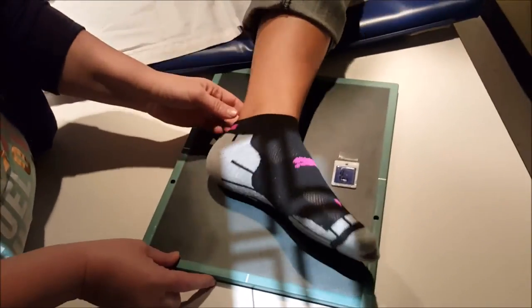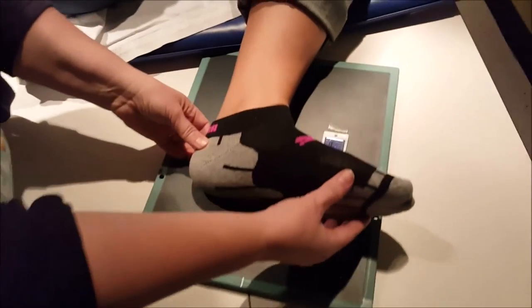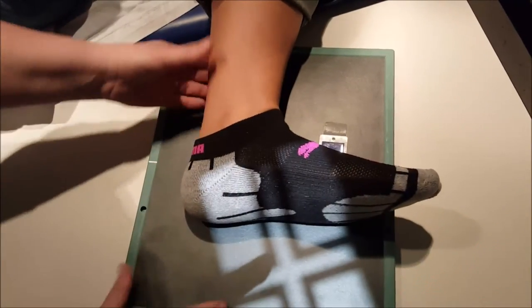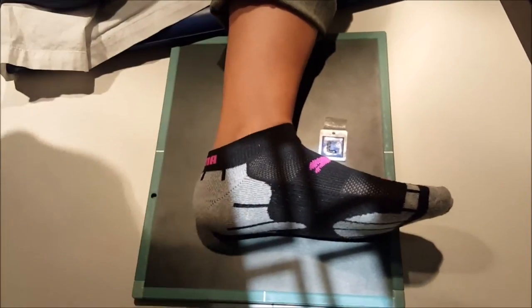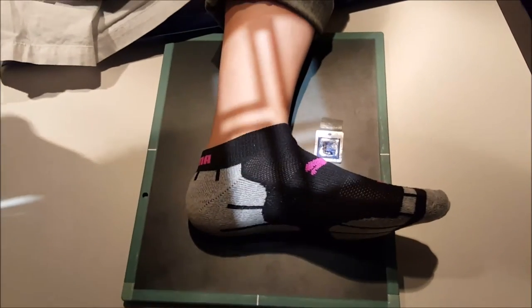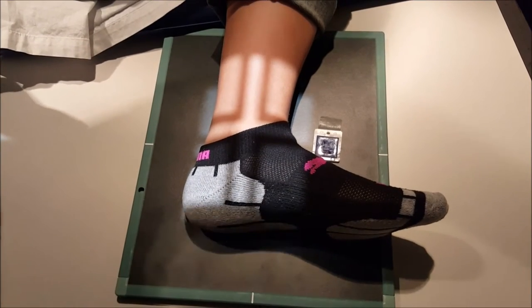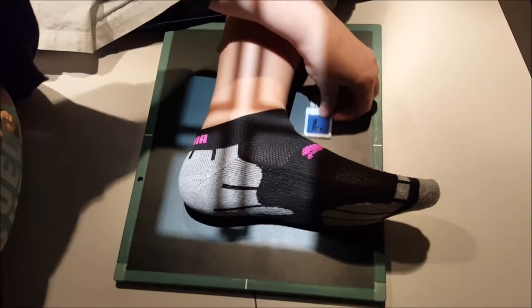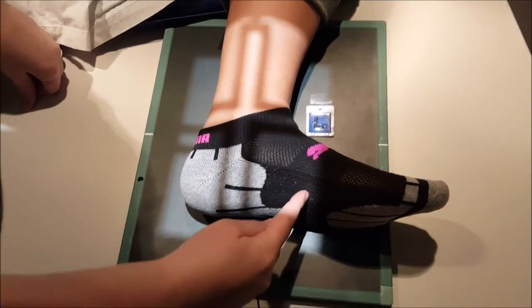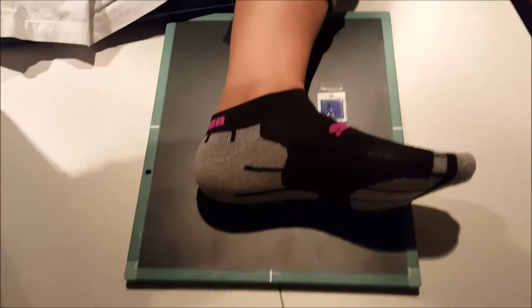For a lateral ankle, you're going to have them put the lateral aspect of their leg against the IR. Often times the patient does have to bend their knee in order to get into this position and that's okay. What's important is that you want this to be a 90-degree angle, so they're going to dorsiflex their foot. We're going to be centered at the medial malleolus. You have to have enough collimation to make sure that you're going to include the tuberosity of the fifth metatarsal.